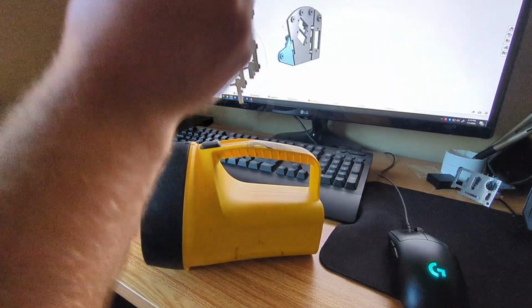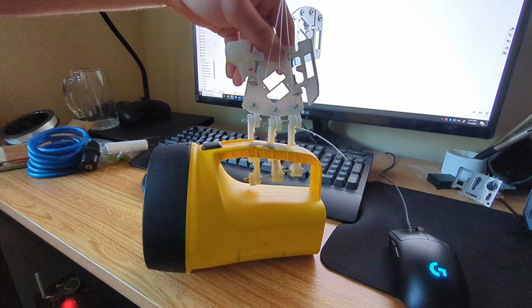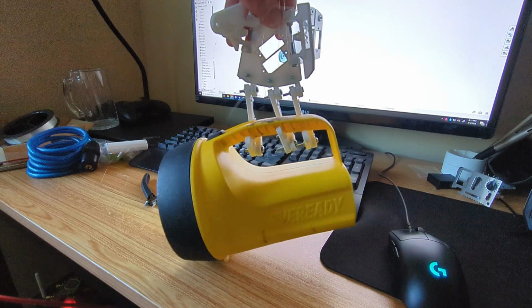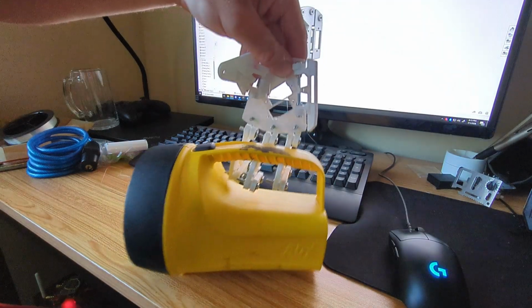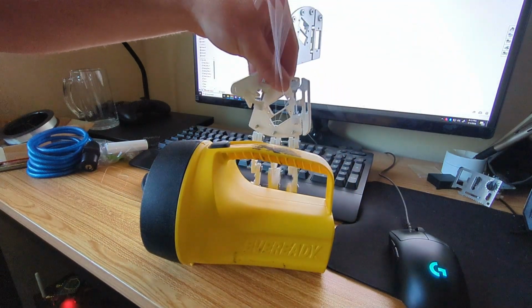Just a quick demo on it grabbing. It takes a good bit of force to get it to grab well, but it does pick up stuff, that's encouraging to me here. Let's see, we grab this, let go. It's actually some of the better grabs I've gotten, and that's just by pulling this guy.